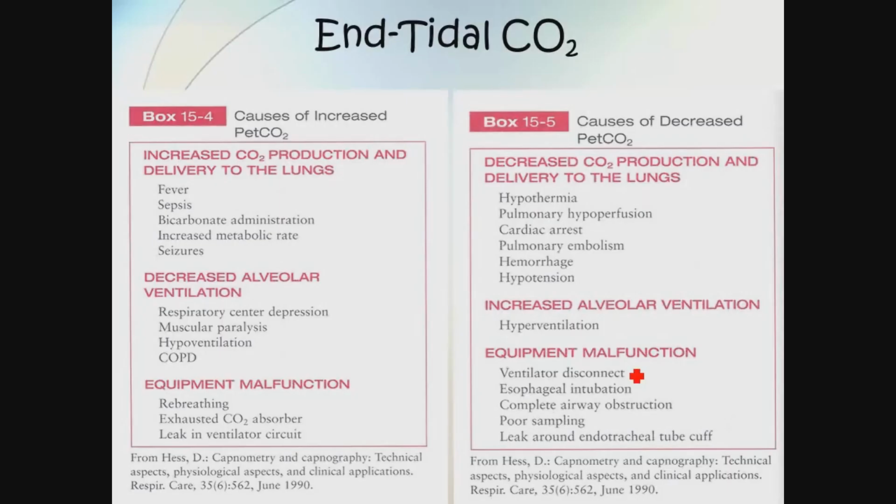I don't know if I blew this up for you in the back. I think I did. If not, this is something that's out of Malley, chapter 15. You know, that red book. But it basically is talking about different reasons why you might have an increase or a decrease in end tidal CO2. Did I not? No. Okay. Well, there it is. It's in Malley. So, might make a good test question when we come around to it.